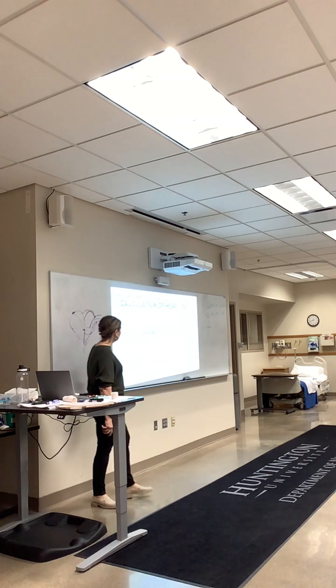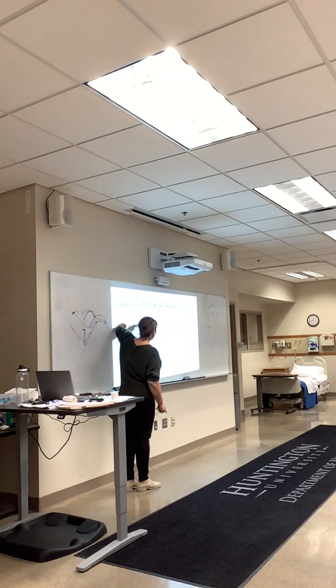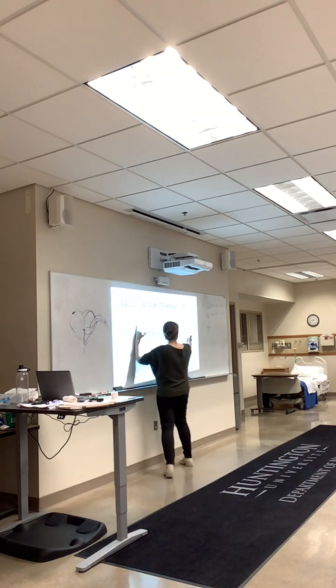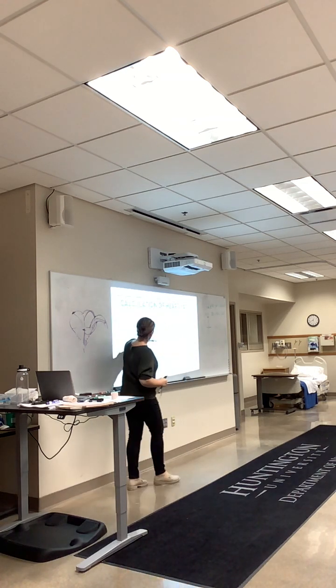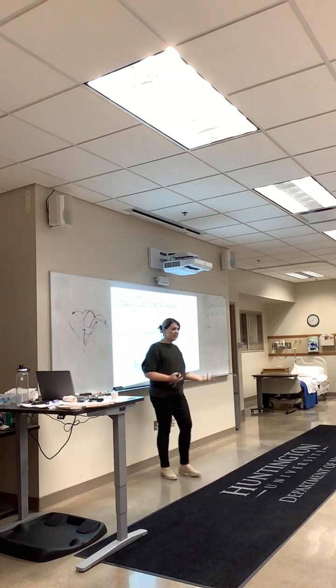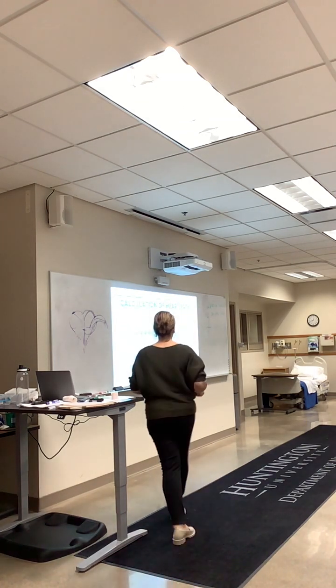Oh, hey, why don't I do another one? Okay, now I'm going to show you here. This is my starting point, so don't count before here. I'm just going to here. So just count in between these 2 larger ones. 1, 2, 3, 4, 5, 6, 7, 8, 9, 10, 11, 12. That's 120. Everybody good there?